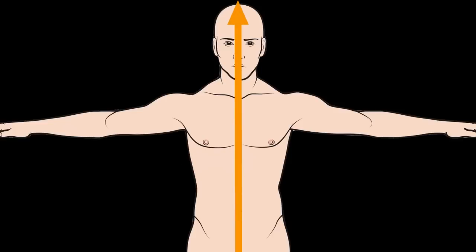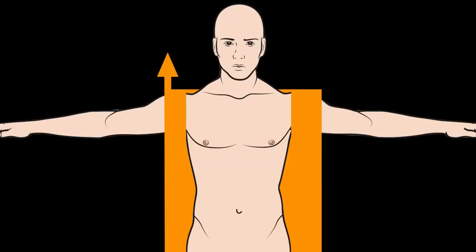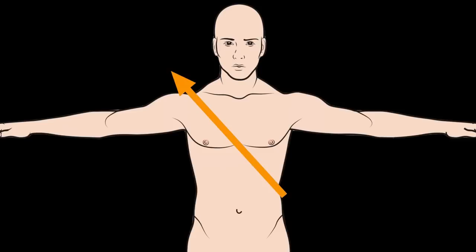Sagittal imaging, meaning the indicator is oriented towards the head or the top of the person or the top of the structure of interest. Transverse imaging means it's oriented to the patient's right or to the right side of the organ. Coronal imaging still orients towards the top or the head of the patient. And oblique is somewhere within that 90 degrees between the patient's head and the patient's right side.